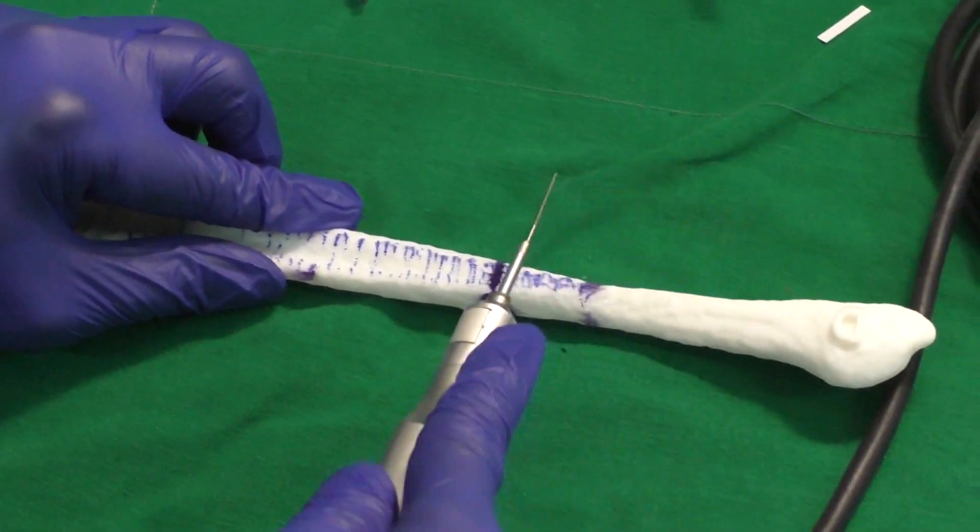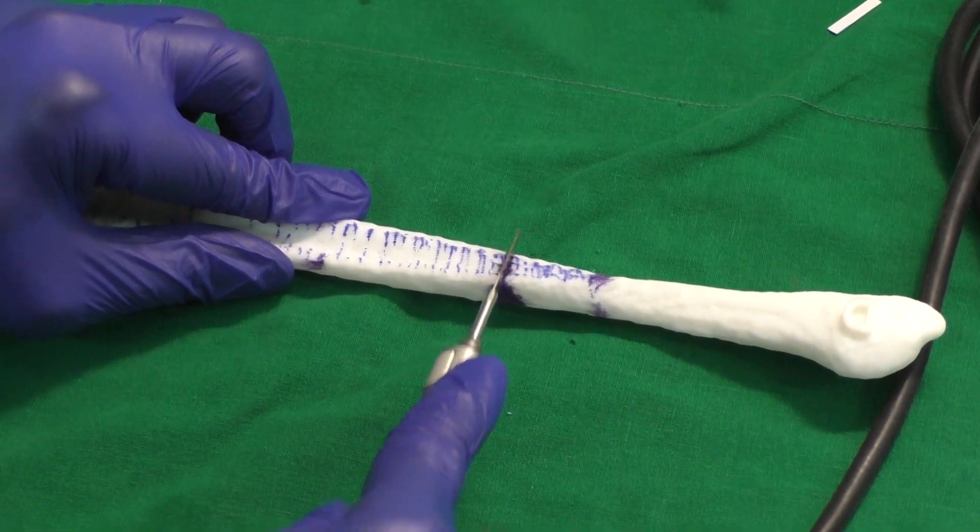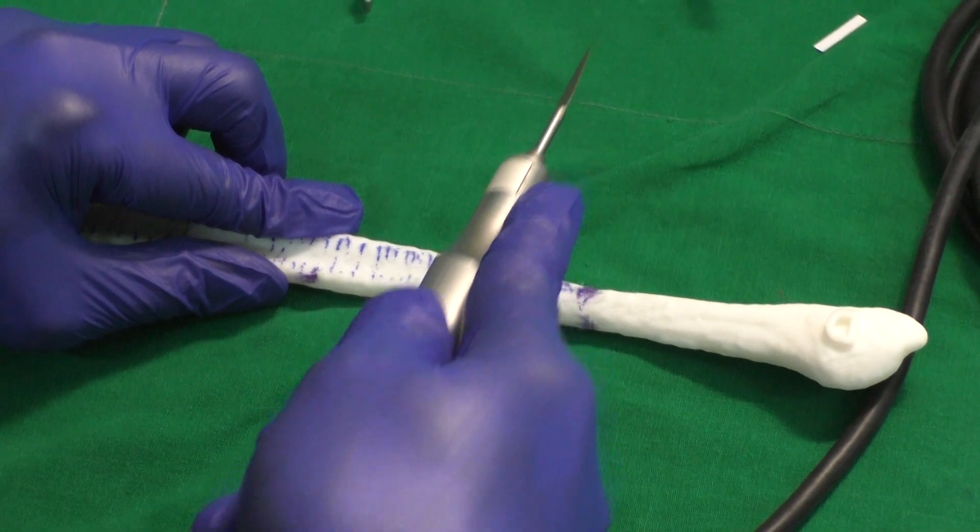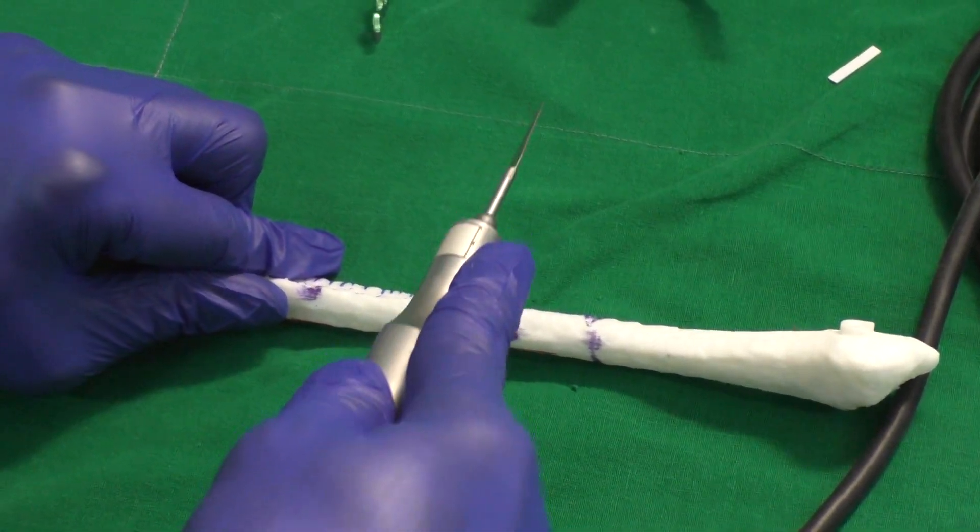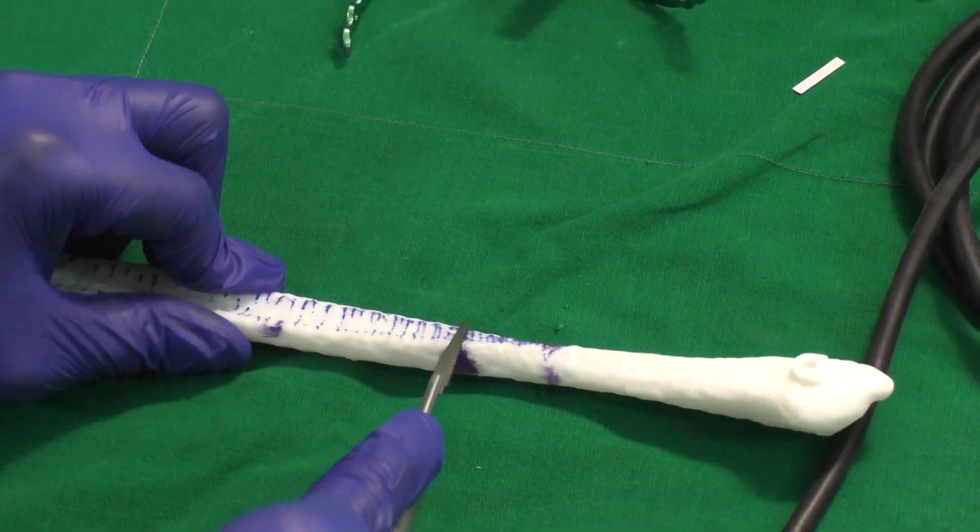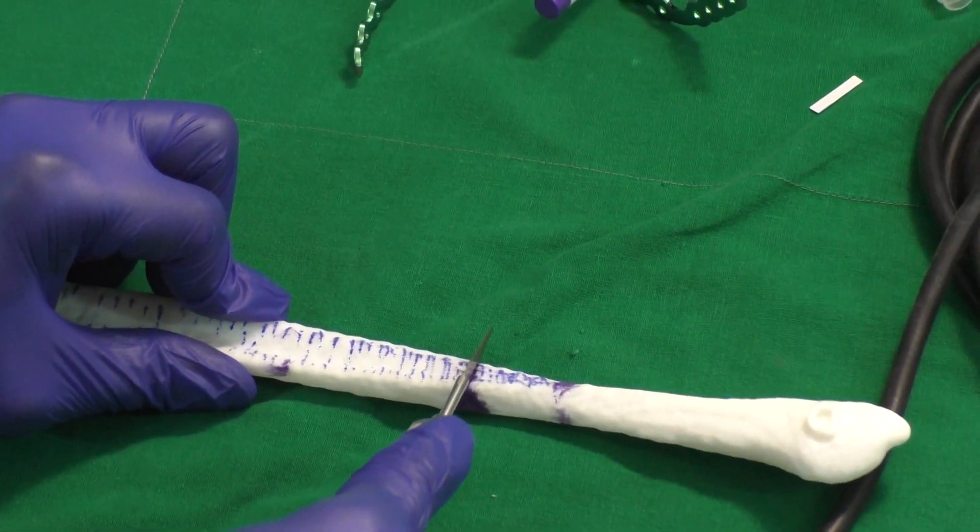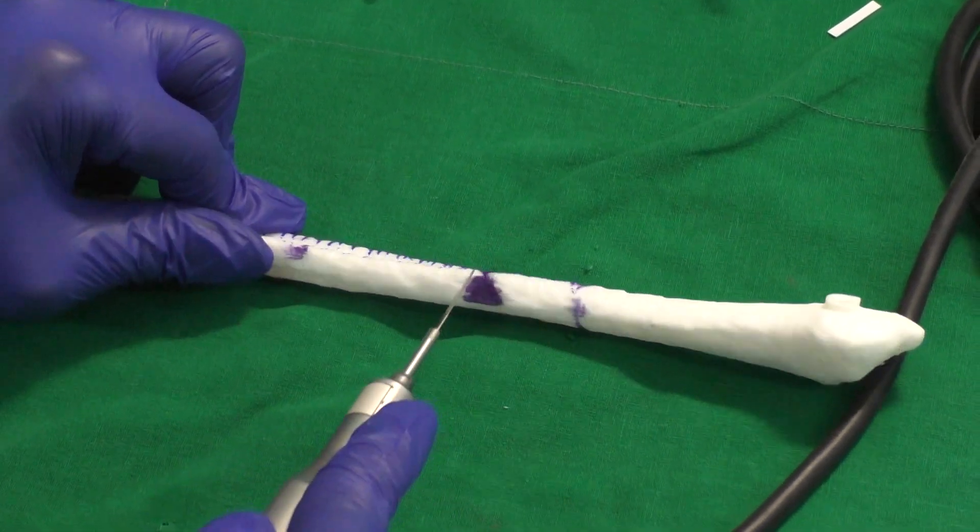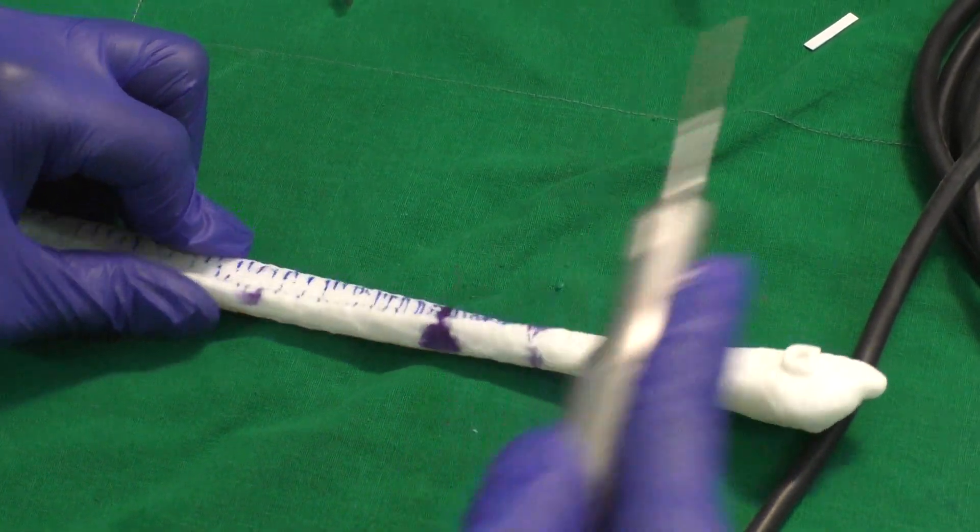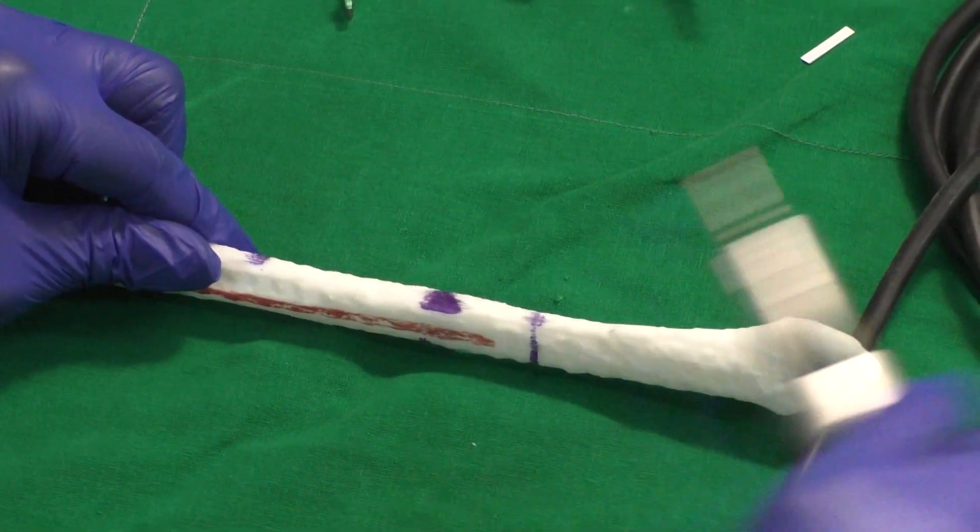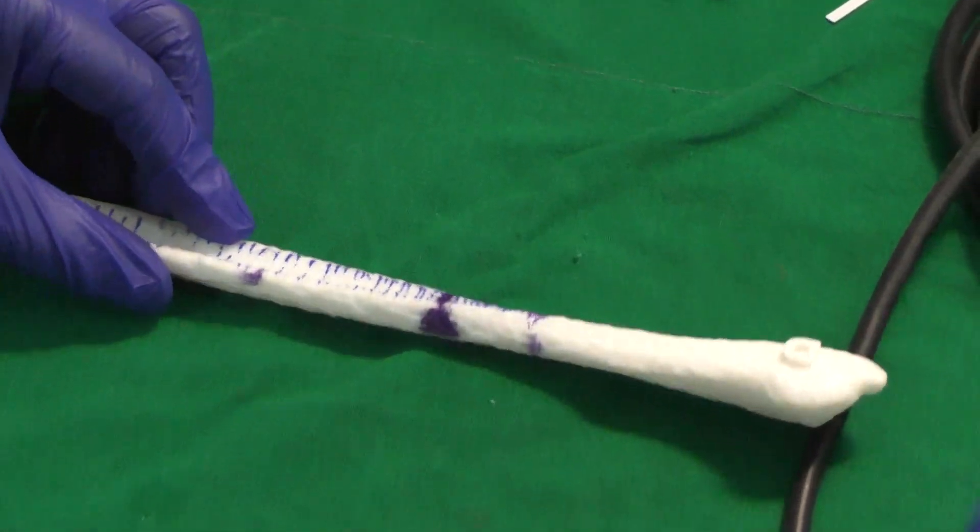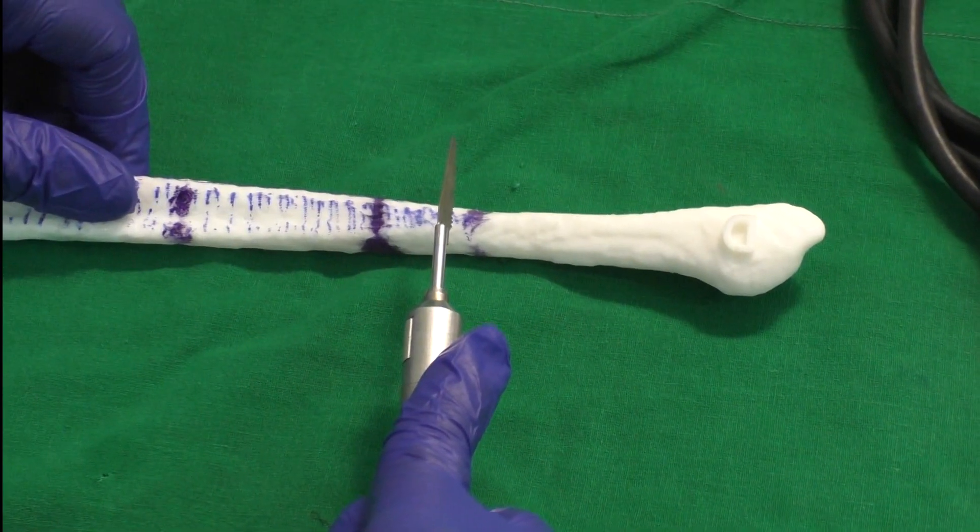This is the most critical part of the osteotomy. Start with your saw vertically downwards for a few millimeters and then stop. Then tilt your hand towards one side and follow one of the sides of the triangle. Do not complete the cut yet. Go back to the apex and repeat the cut on the other side of the triangle. Remember the pedicle is posterior and it has to be separated in a subperiosteal plane to avoid damage.